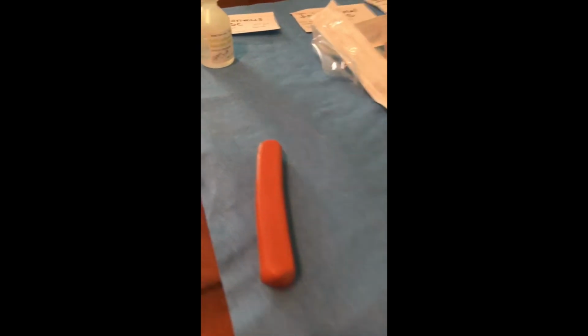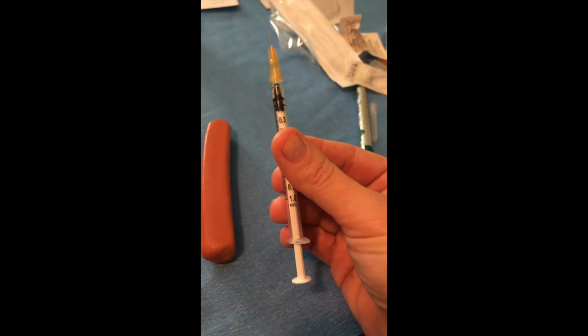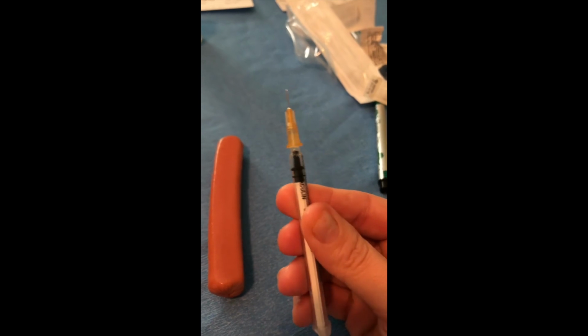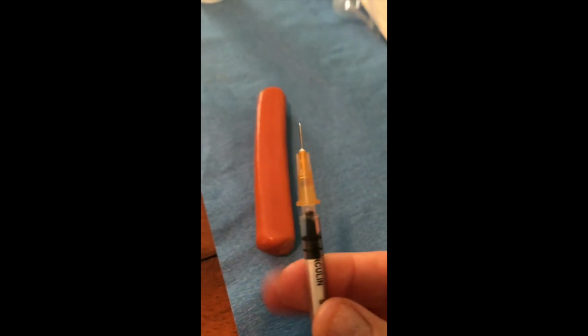Okay, I went ahead and drew up for the TB skin test. You can see I've got the little 1 ml syringe. I've got the 26 gauge needle on it. I'm going to try to do this with one hand. Okay, and I have my hot dog wiener. That's what we usually practice on.